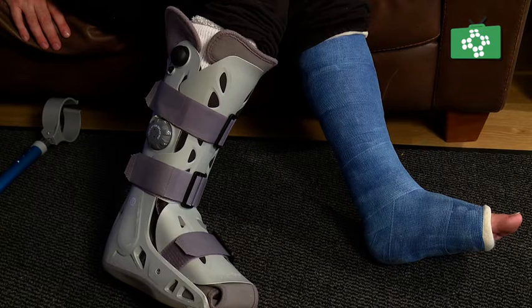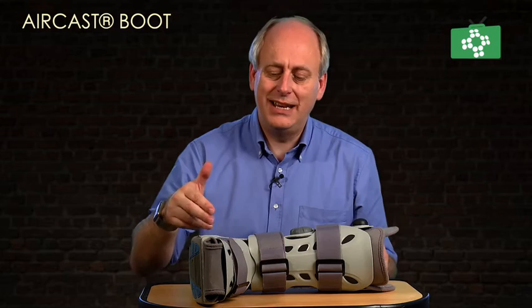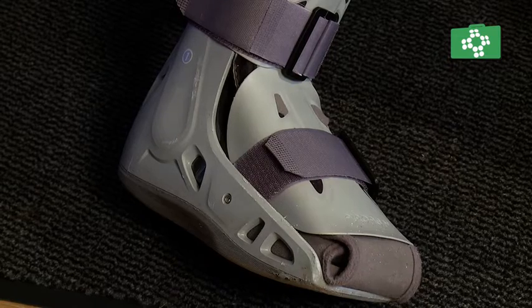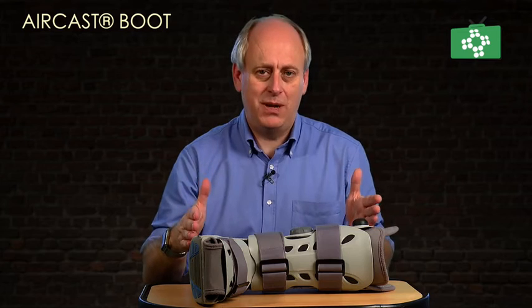The boot itself is very straightforward. There are three key sizes: small, medium, and large. This one's a medium, based on a size 9 men's, but you can look and see which size you need. The boot itself is solid in its construction, and the reason it's better than a lot of the others is there are three independent air chambers that support and hold your foot and keep it immobile.